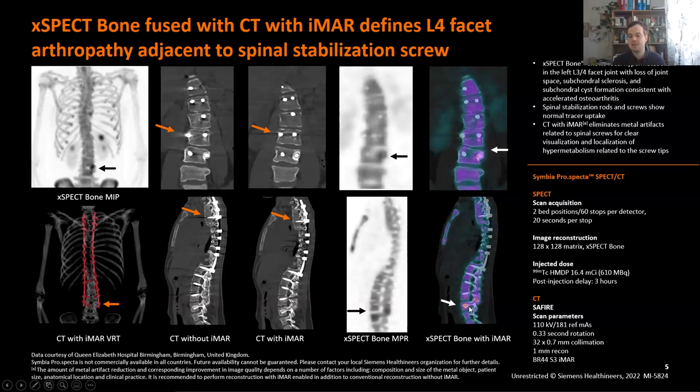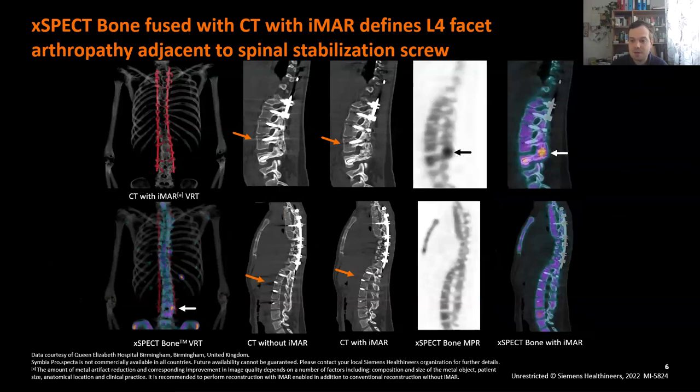And this symbolizes that there is a degeneration happening in the bone. And this is something that we can now see with this physiology changing, but the anatomy might not have changed. Here are some more images of this, and you can see this a little bit clearer on the right side, that there is really some degeneration happening there. And the consequence is that the screw is loosening.